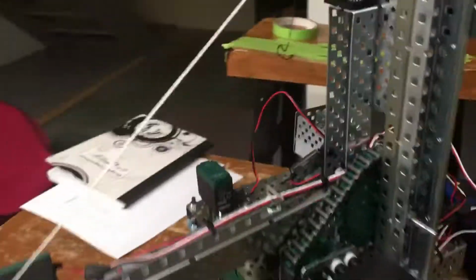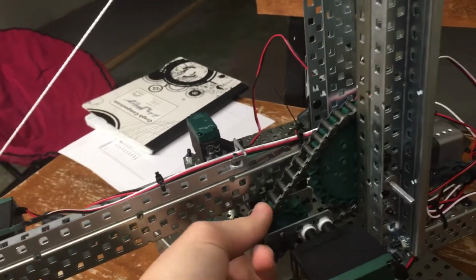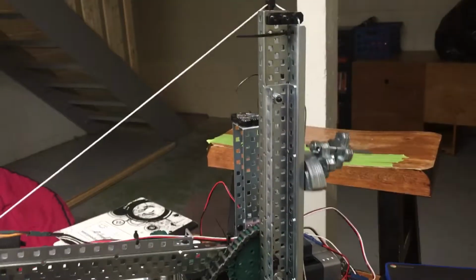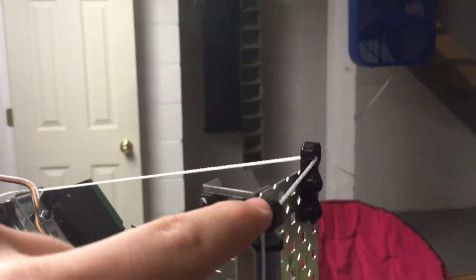Next we have the arm here, which is on a chain and sprocket at the moment, and so 2 393 motors power this axle down in here, and it powers this, and it allows it to raise and lower. And when the arm raises, we have a counterweight back here to help the motors make sure that they are able to lift the arm. As it goes up, the counterweight goes down, and it follows along this track so it never comes off course. It's through some strings that are redirected by some shaft collars here, and the string goes that way.